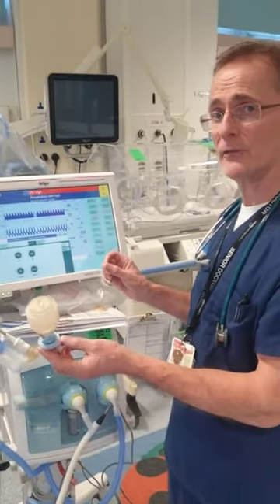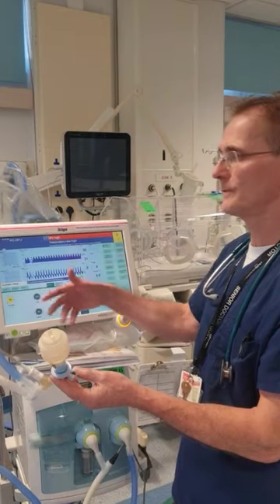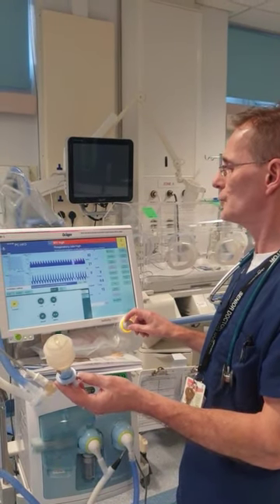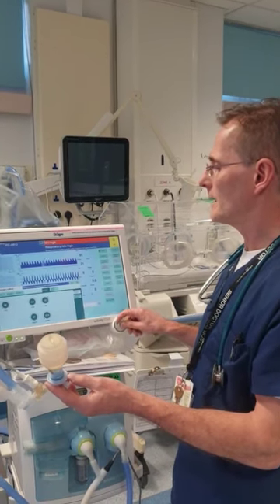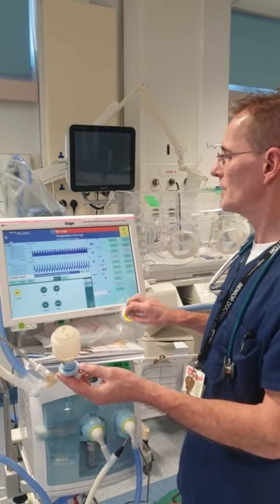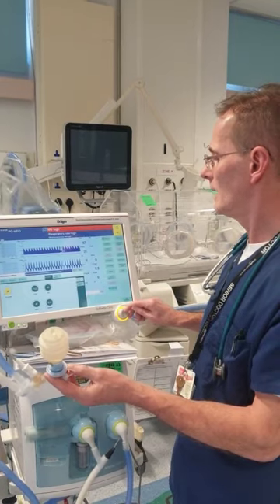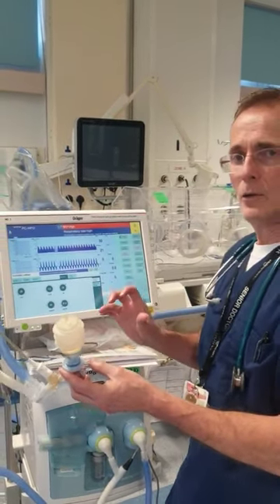And it's as good as that, high frequency. When you've got the lungs distended up, you'll find that over the course of half an hour or a period of time, you can gradually get the FiO2 down. And let's say we get the FiO2 down to say 25 to 30% on this certain distending pressure. That tells us the lungs are open and we're on a low amount of oxygen.